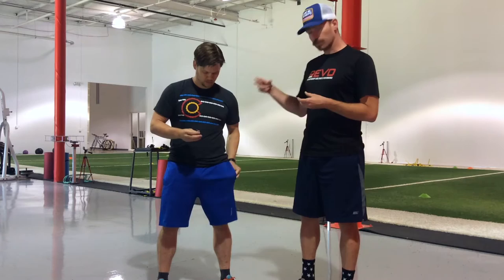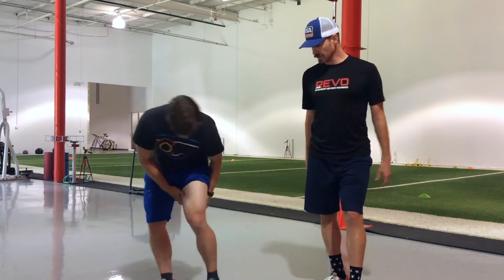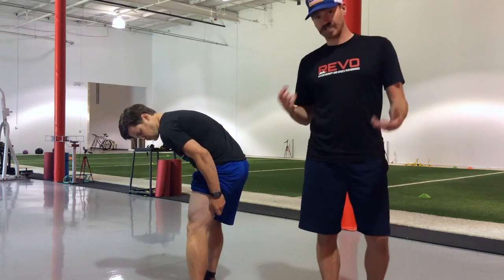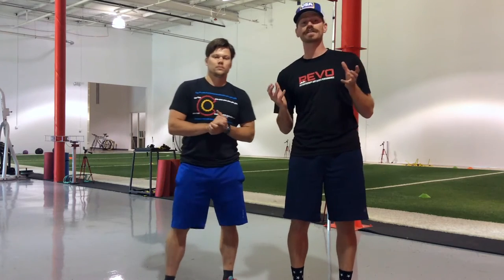We already have two sensors on Brian's hips, one on a hamstring, so we're going to put another on the hamstring. It's really easy — we just literally stick it right onto the skin and it stays in place whenever we're doing any kind of activity.